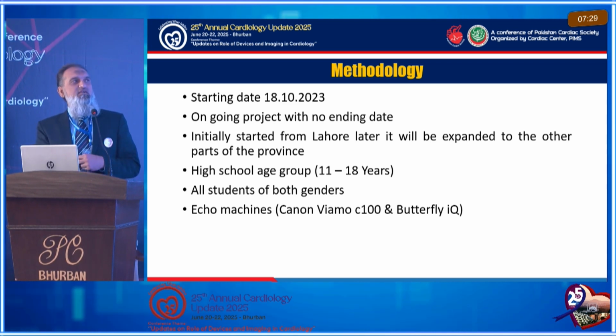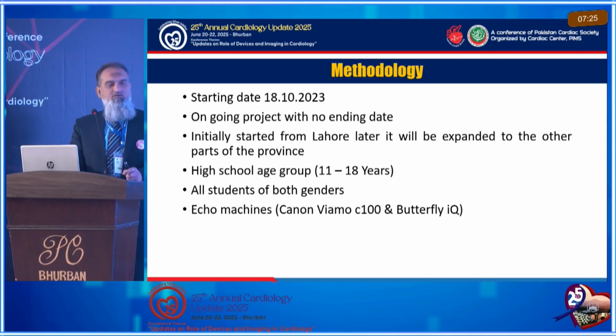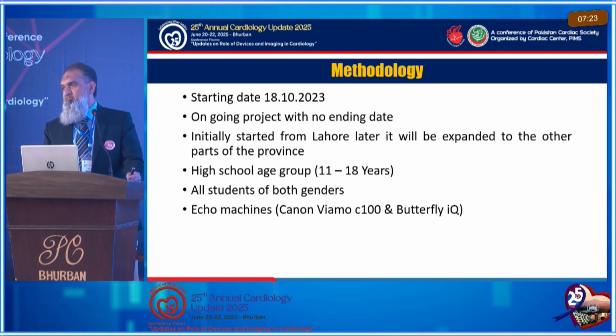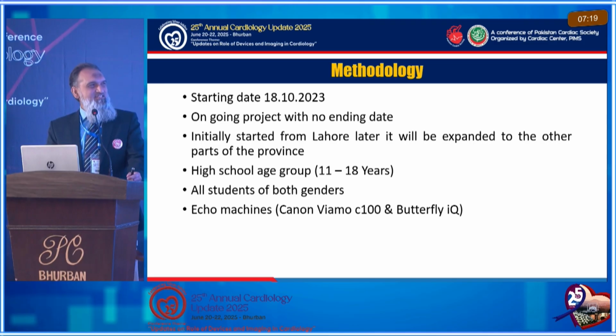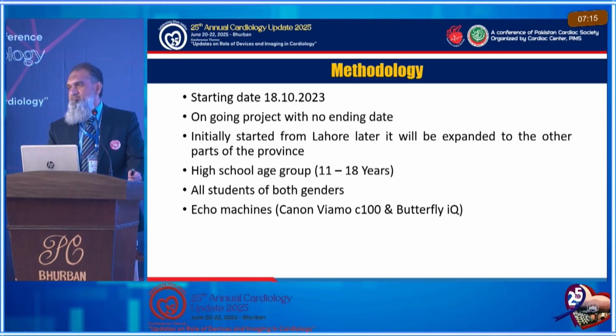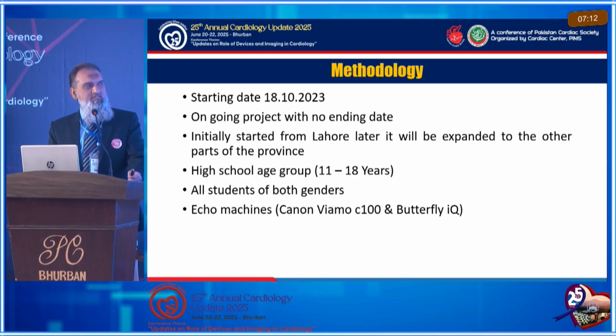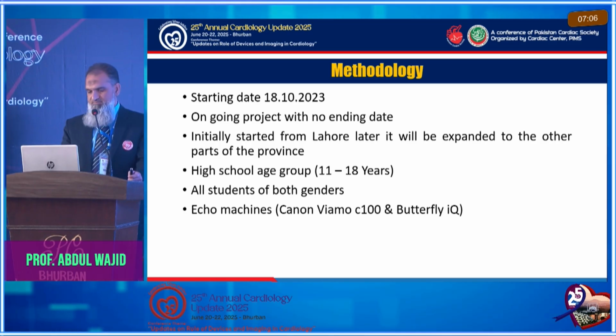So, methodology. We started this program on 18th of October, and it's an ongoing project with no ending date, till the end of life. It initially started from Lahore, and I am preparing to go outside Lahore as well. High school children, all students of both genders. The echo machines I use are Canon and Butterfly.